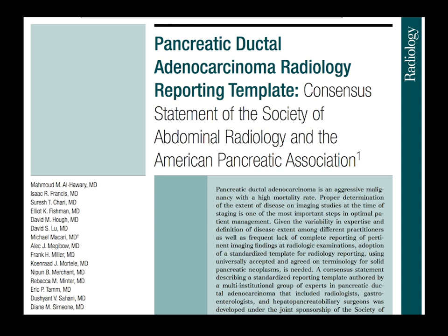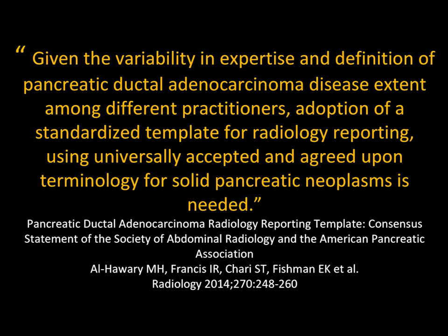Now, in this article talking about templates, this was done to be able to have a template where multiple sites can read pancreatic cancer studies and they'll be able to do trials and read the studies similarly at all places. But what happened was when we started getting together about doing the templates, you realized that unless the protocols were the same everywhere, the templates were meaningless.